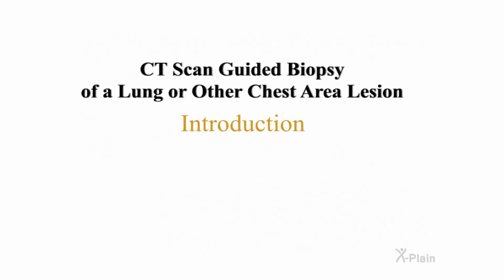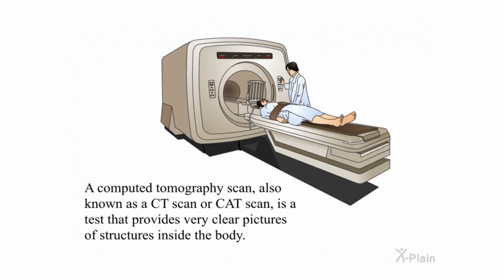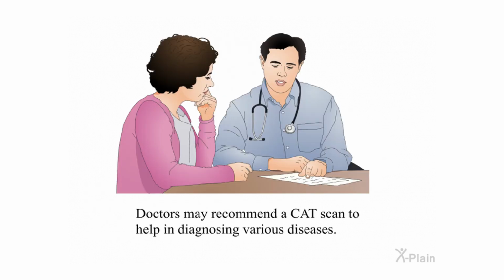CT scan guided biopsy of a lung or other chest area lesion. Introduction. A computed tomography scan, also known as a CT scan or CAT scan, is a test that provides very clear pictures of structures inside the body. Doctors may recommend a CAT scan to help in diagnosing various diseases.